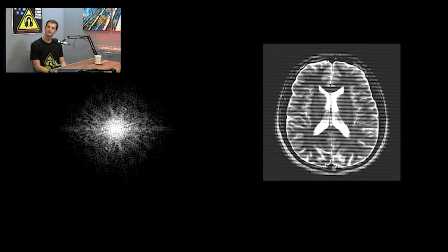Can you toggle up one more slide, David? So I put it on the bottom, but I could have put it on the top and it would have done the same exact thing, and it would cause that effect. That's actually important for half Fourier acquisition. In partial Fourier, you're catching at least half of K-space, say 75% or more. The part you're not acquiring is actually just reflecting whatever is up top. That's one thing you learn from K-space: it's just folding over whatever was there.